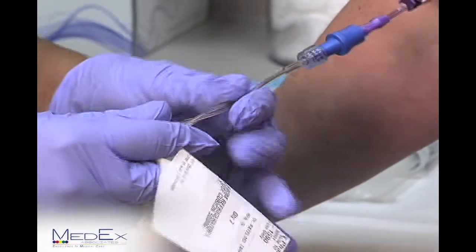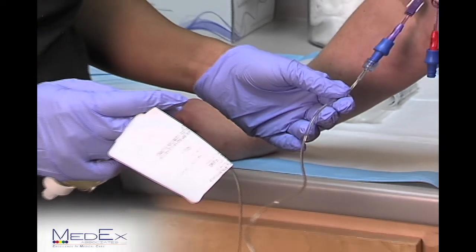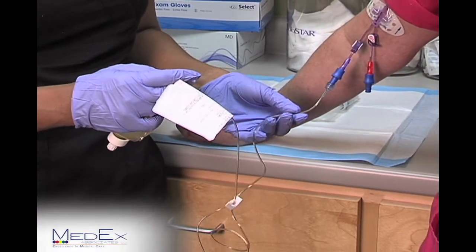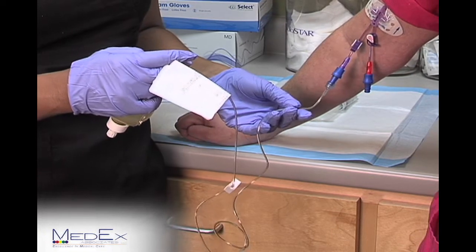The antibiotic can be carried around in your hand or kept in the chair or wherever you feel comfortable. It does not have to be above the level of your heart.